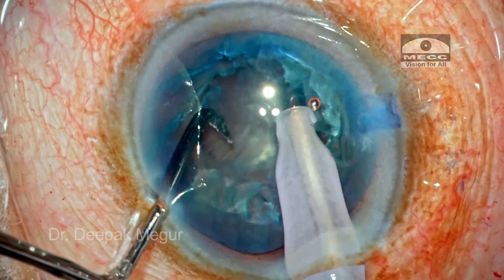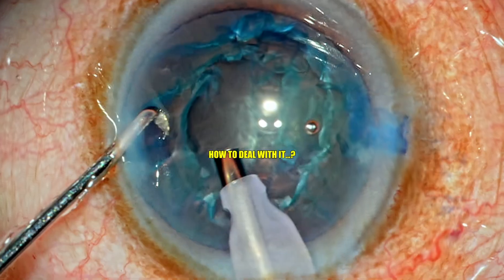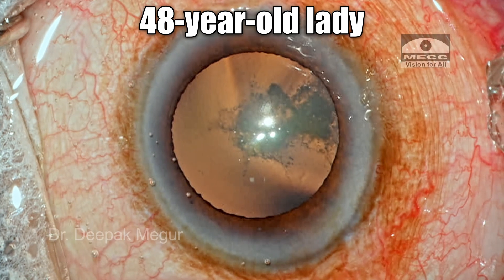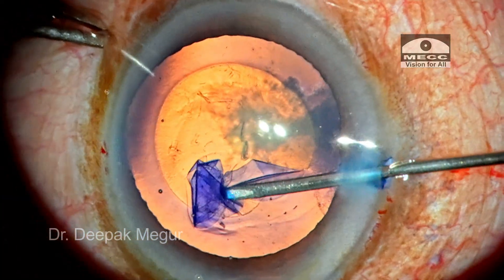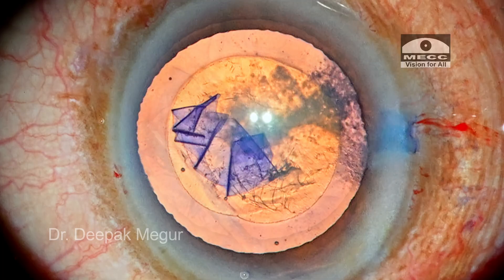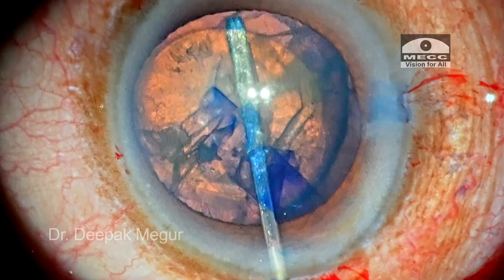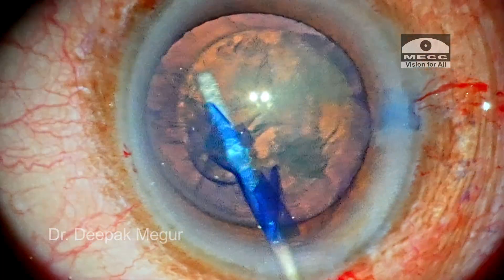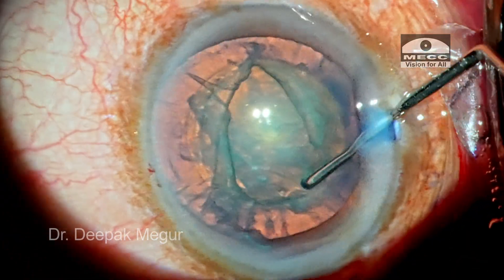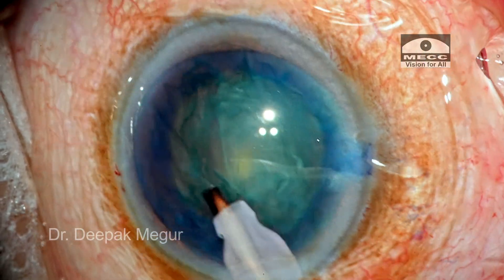In this video, there are situations where an eye surgeon can get stuck because the nucleus won't divide. She is a 48-year-old lady and we expect a very soft cataract. The rhexis is done, of an average size, and I have done hydrodissection. Nucleus rotation is confirmed — quite good. I have not done hydro delineation, which probably would have helped, but it escaped my attention as I usually don't do it. This is one such case where it probably would have helped.